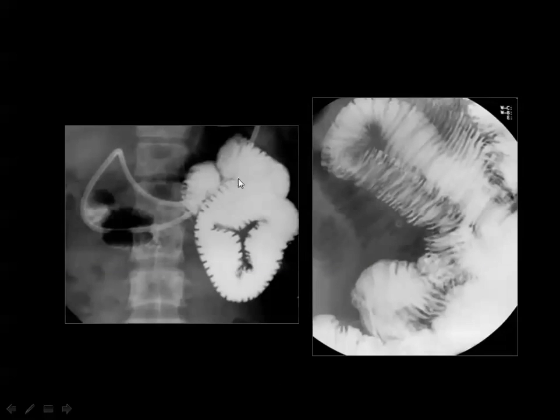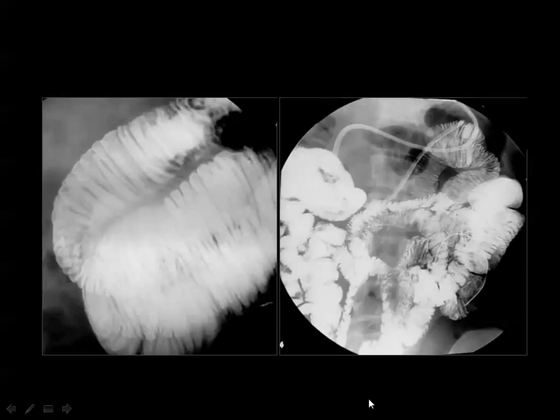You see here is the tube, and we start injection of barium, and you can see the beginning of the jejunal loop. Then if you inject the methyl cellulose, you will see the appearance better, and this is known as double contrast study of the small bowel. And there is adequate delineation of the mucosal folds as well as the whole segments of interest.